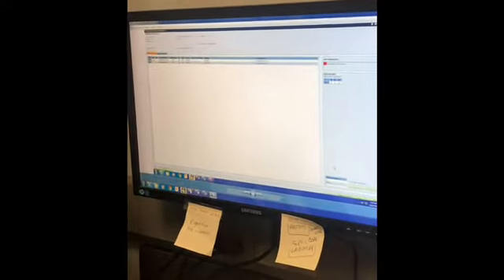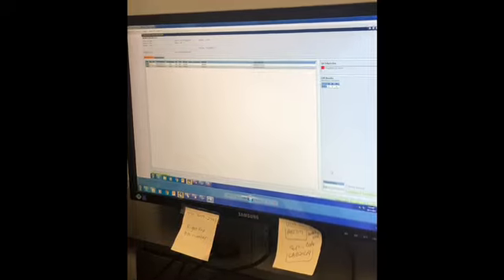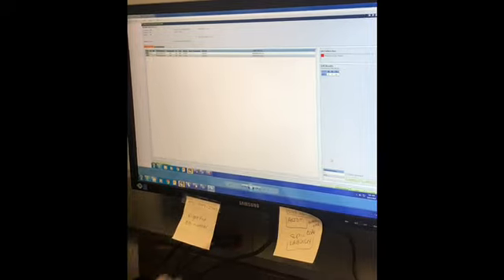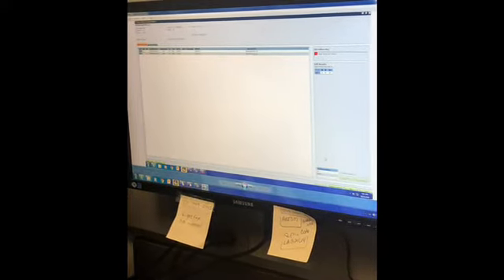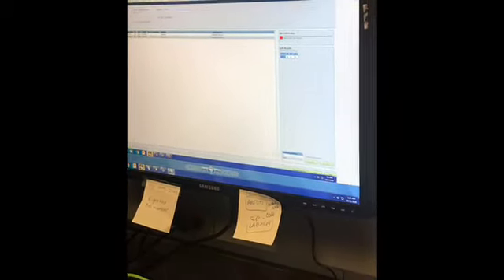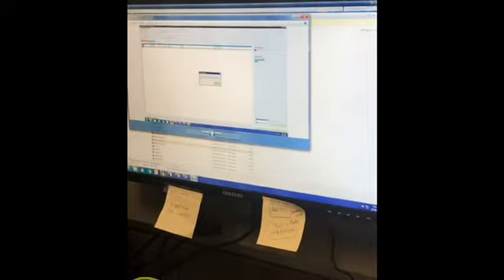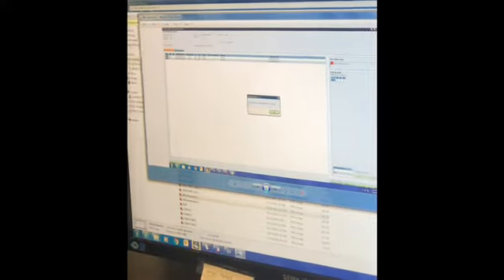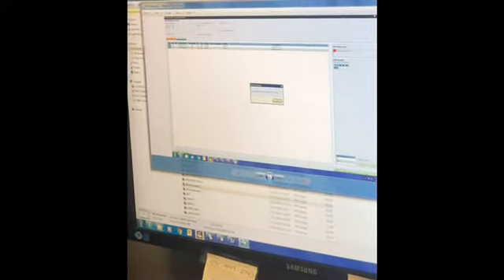So if you see it pop up in red, then you know something is wrong. Maybe the ABO types didn't match, or the unit number didn't match. But most of the time, what was put in BPE doesn't match what's coming off the Vision, which is the ABO RH type. Okay. So once you hit release batch, this is going to pop up: all released instrument data files successfully. Once that says successfully, then you know everything has crossed over. And then you just hit OK.